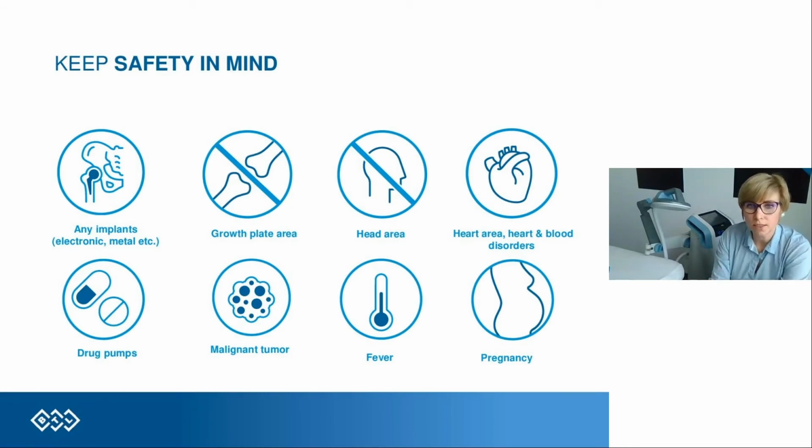Regarding the contraindications about this device, in case of using the pulse electromagnetic field, we have to be sure that the patient has no implants, electronics or metal, because in this case the metal can burn, can overheat.